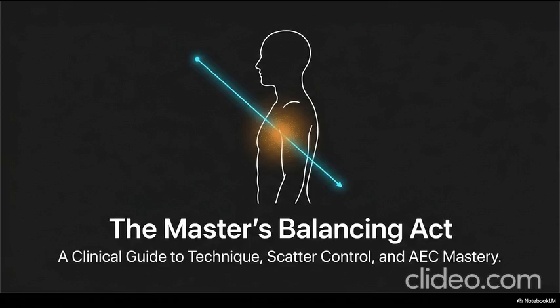Oh, I see. It distorts the image. Exactly. The air gap technique does the exact same thing to internal organs. It cleans up the scatter, sure, but it creates unacceptable magnification and penumbra, which is the blurring of the anatomical edges. Okay. So we are back to collimation as our best defense. Just shrink down the light field with the lead shutters.